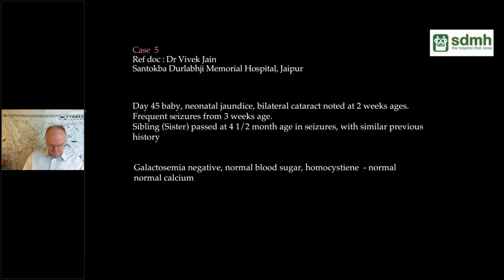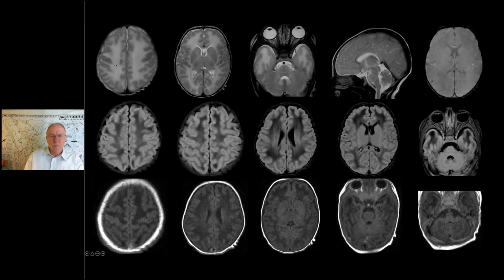Thanks. Okay, thank you. So this is day 45, and on the top you can appreciate there is diffuse abnormal white matter changes in the cerebral hemisphere on both sides. The periventricular subcortical white matter also, subcortical is slightly difficult to comment on because of the unmyelinated brain, but the central white matter also demonstrates these high signal changes. In the temporal lobes, there is some differential T2 hyperintensity more along the temporal poles. I cannot appreciate any posterior fossa changes. Brainstem appears normal, corpus callosum is normal for the age. No blooming foci on SWI.